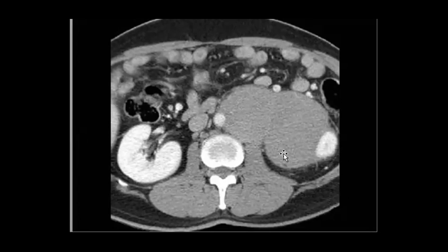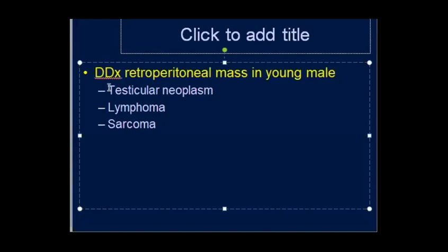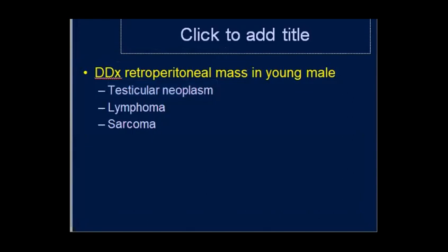The metastasis, as we mentioned, from prostate or kidneys, can spread here, and lymphoma and leukemia, as we mentioned, will be your differential diagnosis. But if it is a young patient, then you should put testicular neoplasm as the first differential diagnosis. Okay, don't forget it when you put testicular neoplasm. Nice that everyone knows it. So this is good information. This one is easy. They like it in spotting as well.